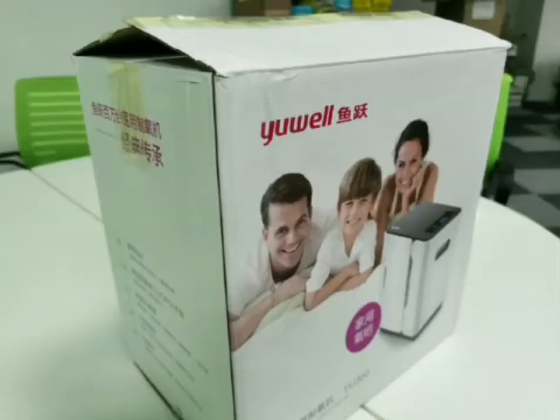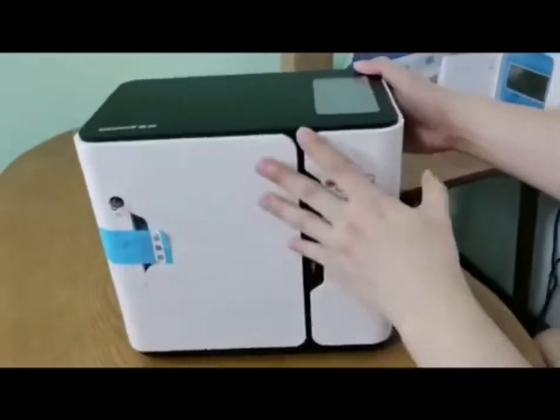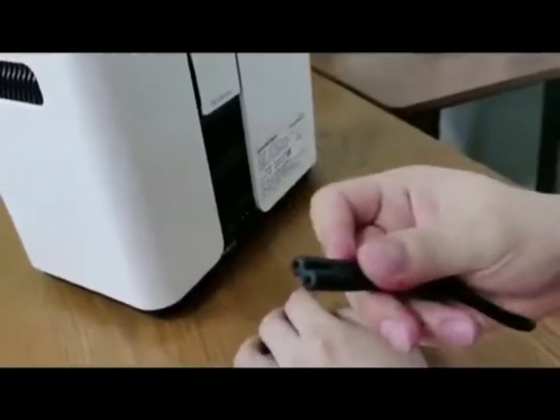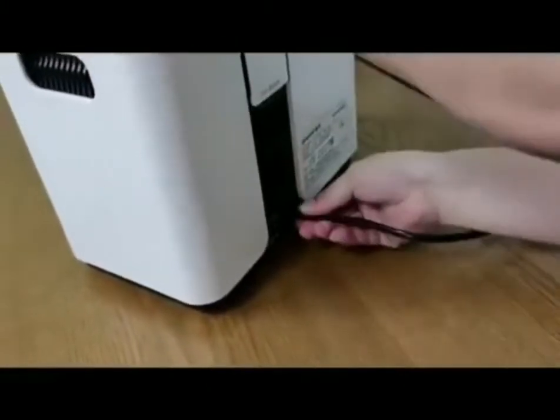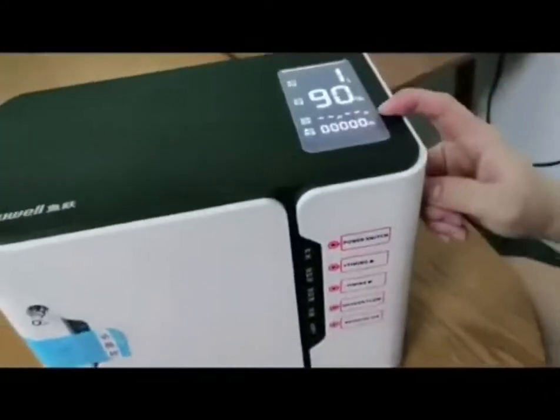Oxygen concentrator — let's start to show you how to set up this machine. We turn it back, this is the power cable, we plug it in and turn on the switch. You will see 'hello' on the screen.